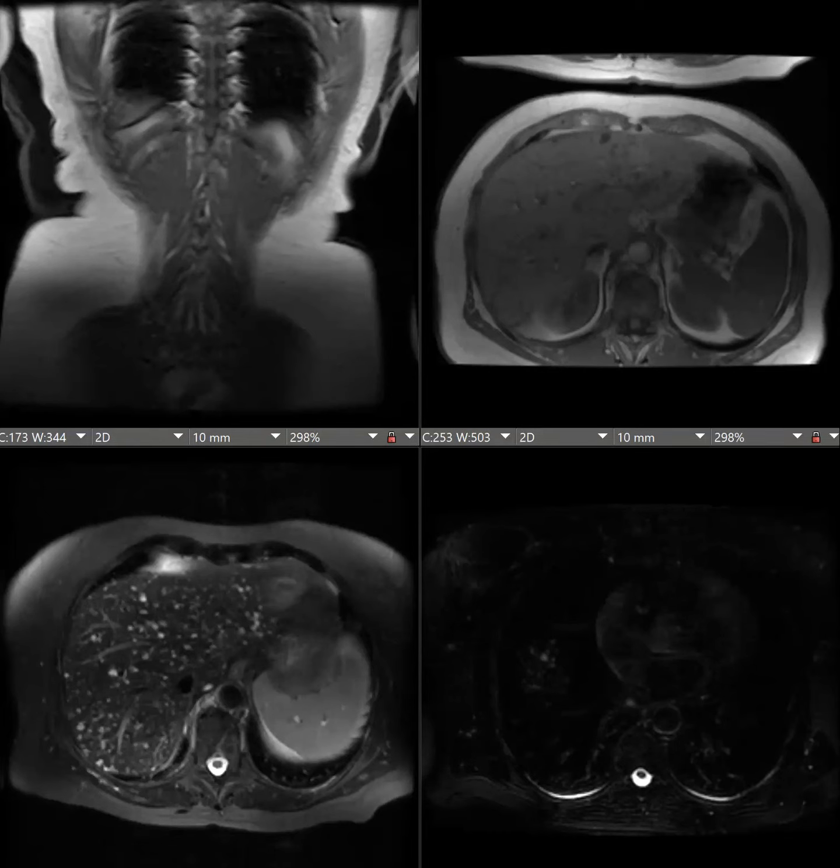I don't know that I have a good grasp of it yet either. We've occasionally raised it when there are multiple weird lesions in a patient with HIV and we don't have any other explanation, and they look blobby and, like Rupa said, have vessels crossing them. It's like liver, not a true mass, but there's some process going on in that part of the liver. So we have occasionally raised it.